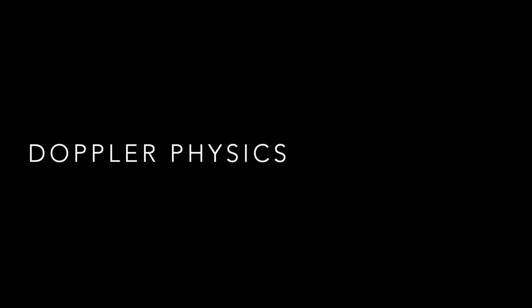So we're going to do this in a couple different broad categories. The first one is I want to talk a little bit about Doppler physics, right? We have to start all these discussions with an understanding of how things work and why they work before we understand how we can manipulate them to make them work to our choosing and to our liking. So let's back up. Let's talk a little bit about some physics, and then we'll build on that to understand some more of the principles of Doppler ultrasound.